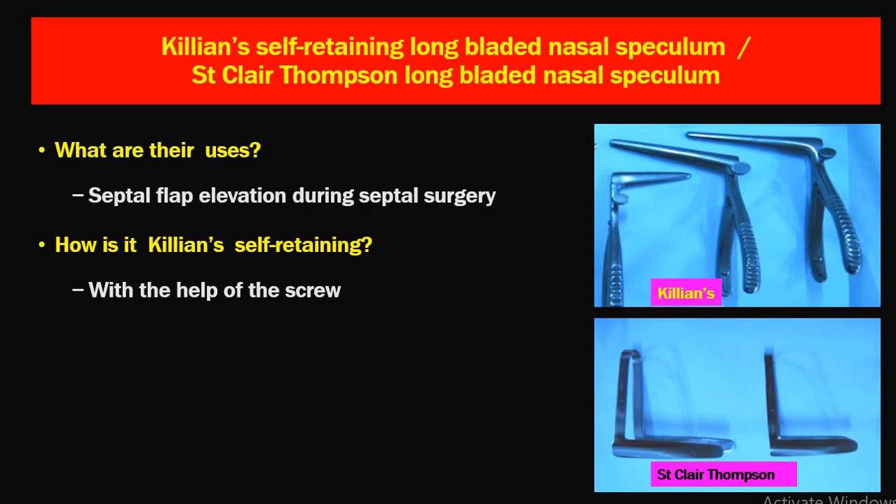The next instrument is Killian's self-retaining long-bladed nasal speculum, and St. Clair Thomson's long-bladed nasal speculum. These are used to elevate the septal flap during septal surgery — either SMR or septoplasty. They have longer blades to reach the posterior nasal cavities. Killian's speculum is self-retaining because of a locking screw — when the screw is locked, it becomes self-retaining.